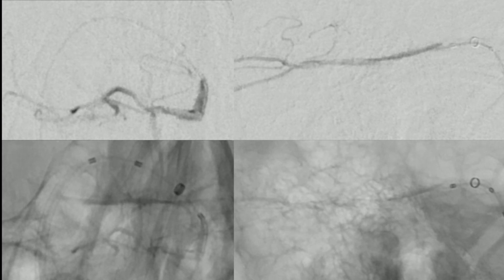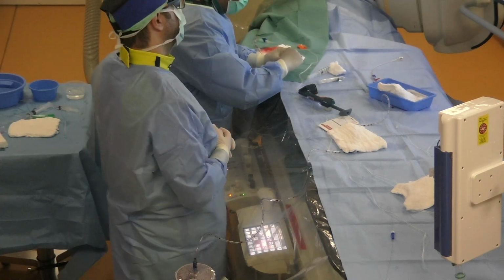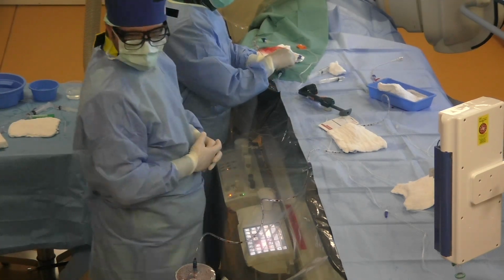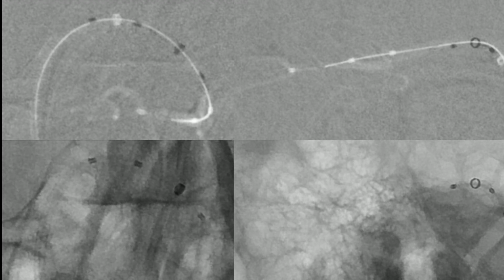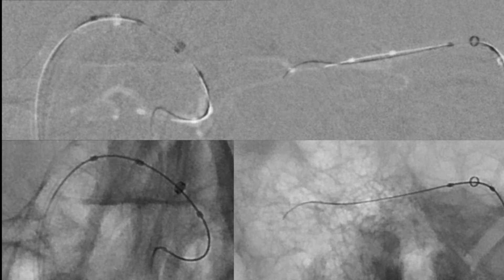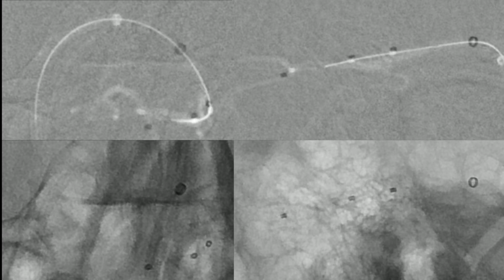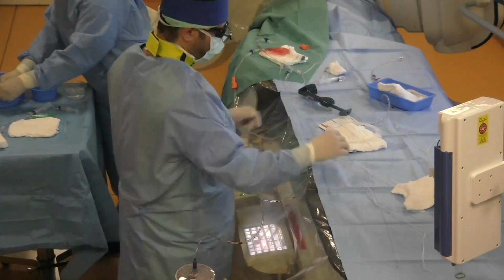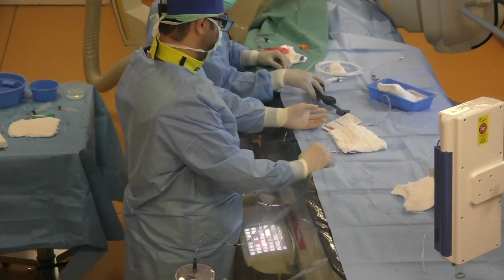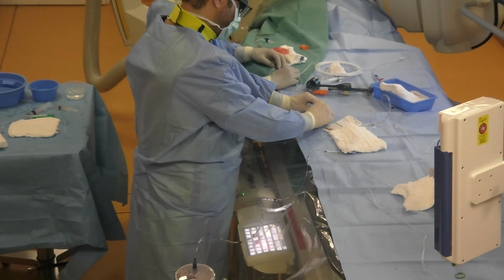And now we can implant our stent. We take at first the microwire and use it to navigate to the distal P2 segment, and we push the balloon catheter through which we will implant our microstent. We take the microstent and insert it into the balloon catheter.